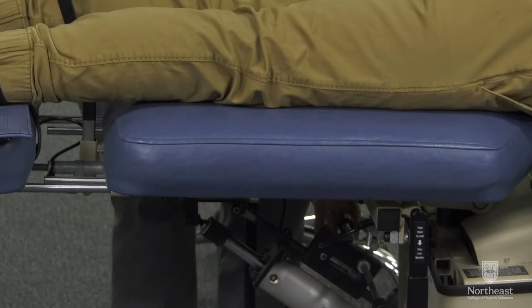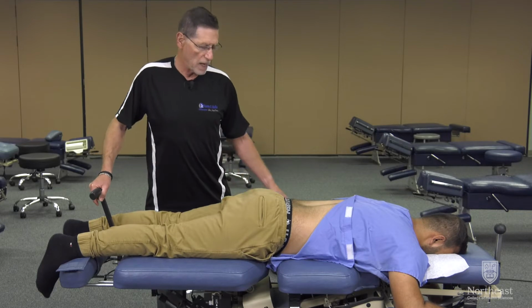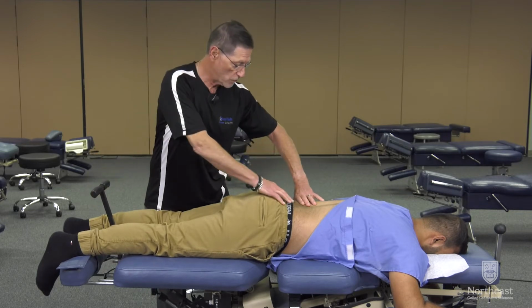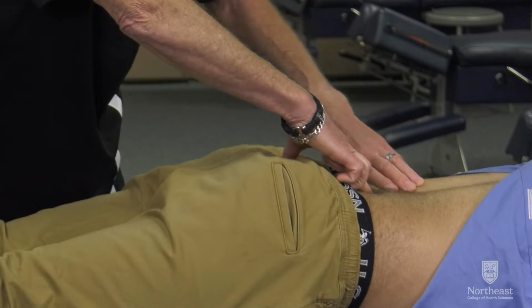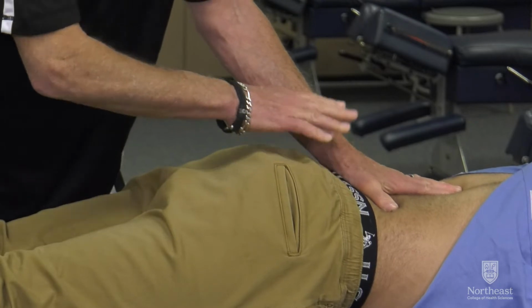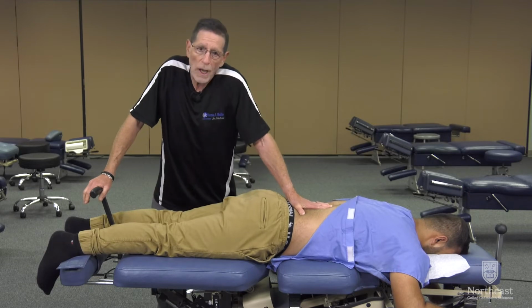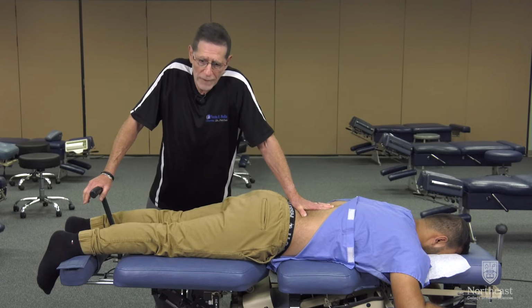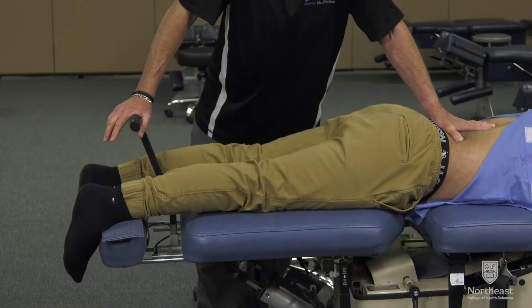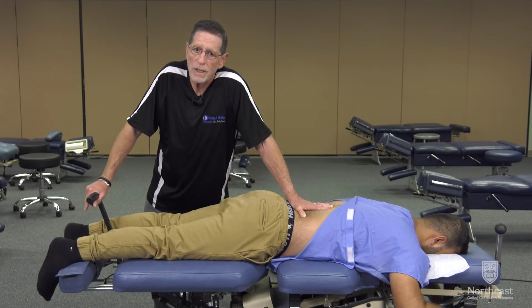And the first thing we'll do is make sure that the patient will tolerate the procedure. And of course, this is called the tolerance testing procedure. So we will find the level of the disc that we diagnosed as the problem and make a contact lifting that spinous process in a headward direction. We apply a certain amount of body weight to the vertebral level that we're contacting, and then match that force by applying a downward pressure on the other end of the table. That's held for about 4 seconds, and then we ease off.